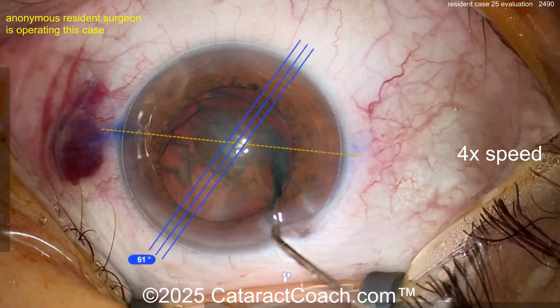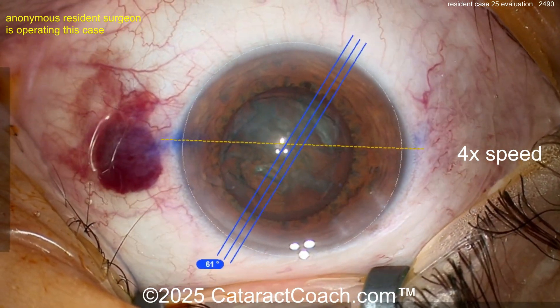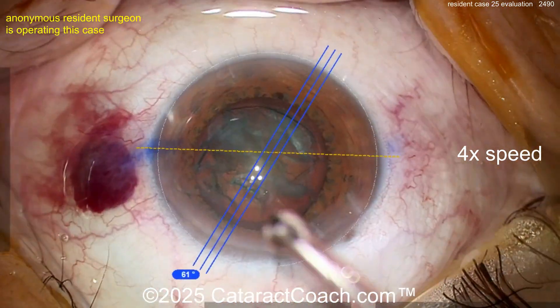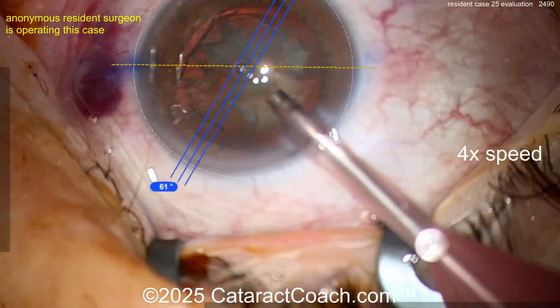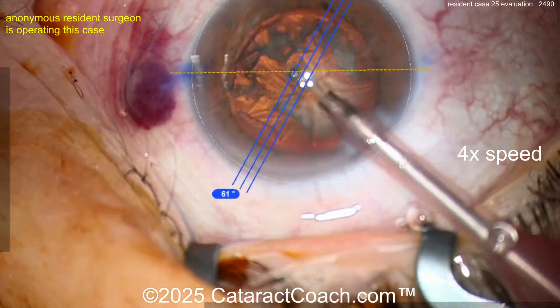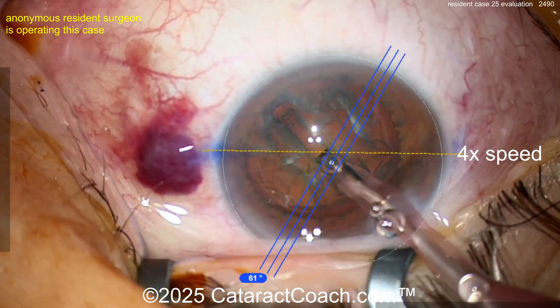I'd turn off your screen overlay here — you don't need it on the entire case. It's just going to make you distracted. At this point you don't need it on. Right now you're trying to divide the nucleus up — why do you need to see where the 61-degree axis is? You don't. Turn off that overlay. You should have a button on your foot pedal or on your microscope.